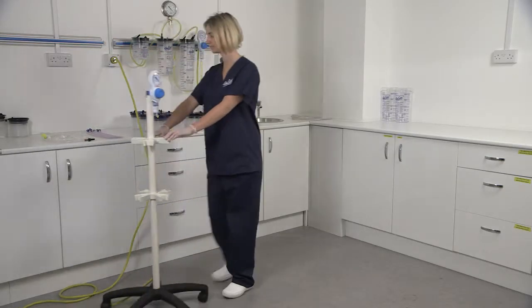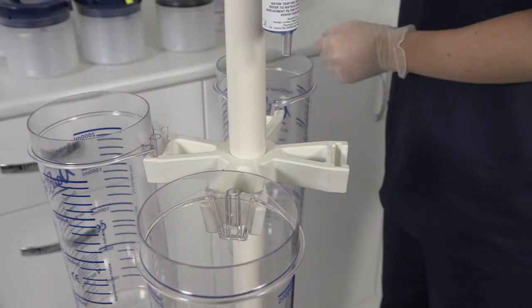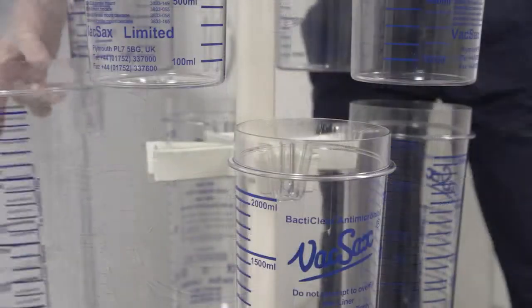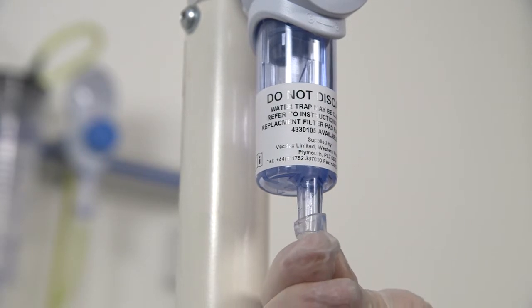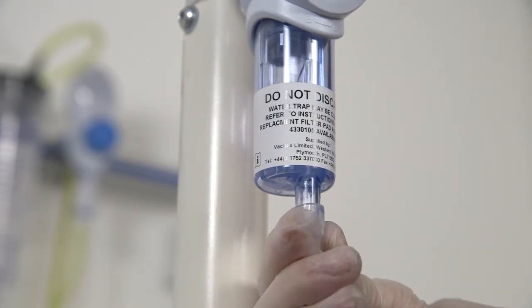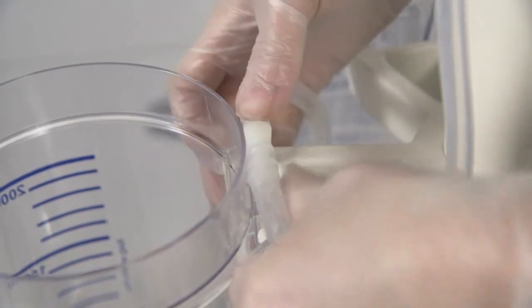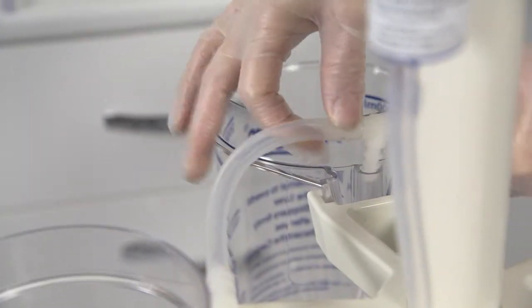Start by putting all the canisters into position. Attach the cascade tubing set to the suction controller, then starting with the first canister to the left of the controller, push the first connector into the back of the canister and continue until all are connected.